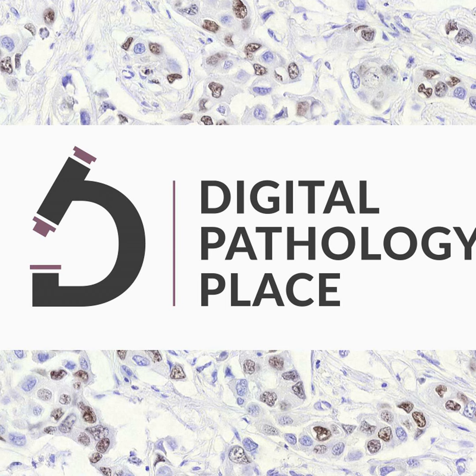But when you also need to detect the epithelium or cancer epithelium, what is the border between cancer epithelium and benign? They're not easy for anybody. So how to convert, because current pathology scoring systems are designed for humans. You can quickly make a good enough diagnosis. So it's a Gleason 5. You have 3 or 5 minutes to score it. So there's no possibility to count 1 million lymphocytes in a cancer.